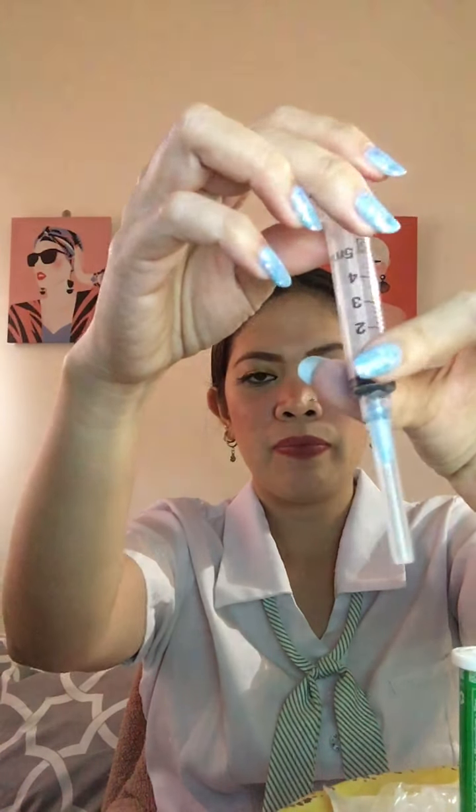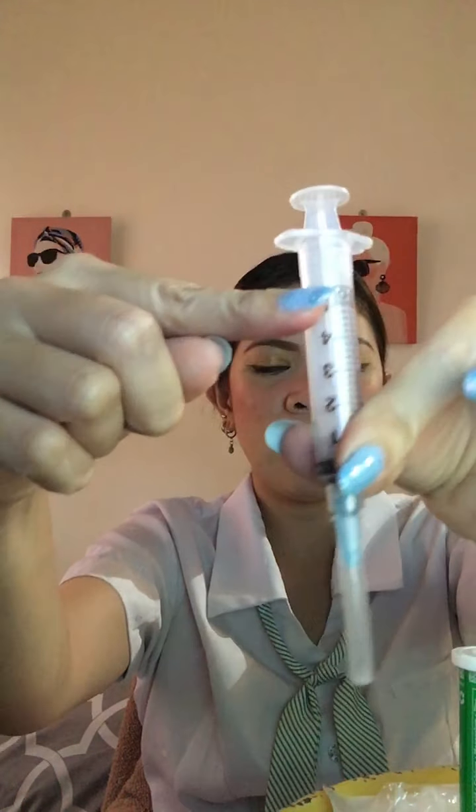So let me just show you. This is the hypodermic syringe. As you can see, it goes up to 5 ml in size. The insulin syringe is similar to the hypodermic syringe, but the scale is specially designed for insulin. As you know, people with diabetes use the insulin syringe because it is designed for insulin administration for diabetic patients.